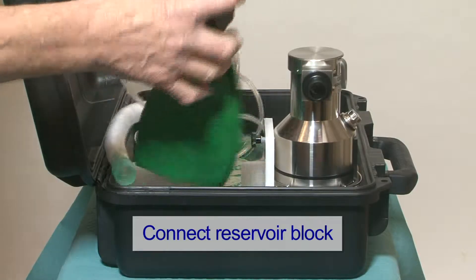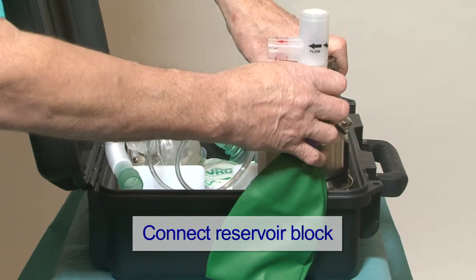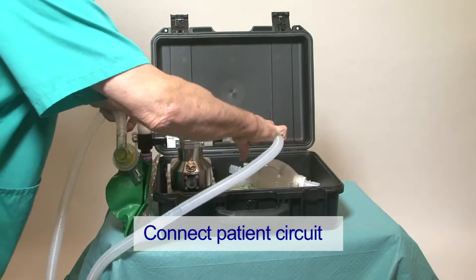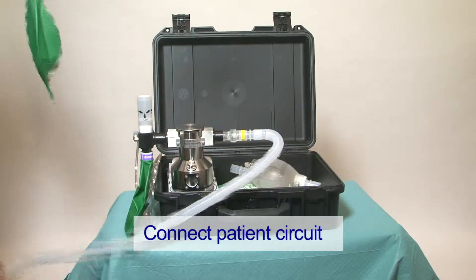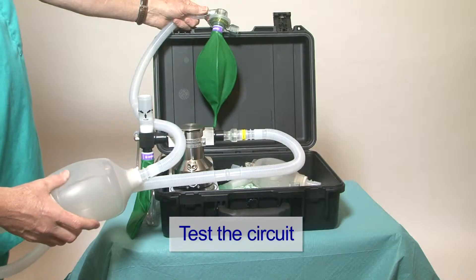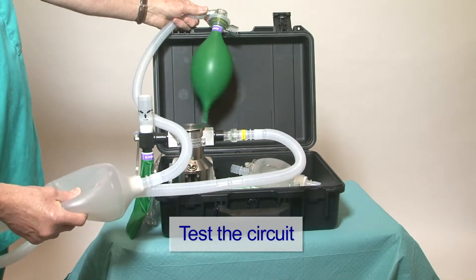Remove the reservoir block and fit it to the inlet side of the vaporizer. Connect the patient circuit to the vaporizer outlet, ensuring the one-way valve is in position. Test the circuit by squeezing the self-inflating bag.